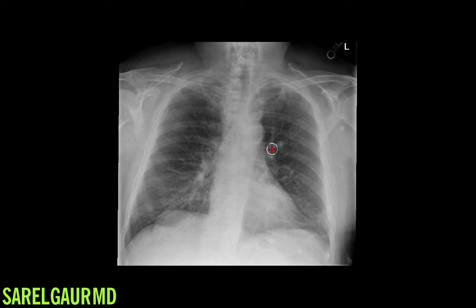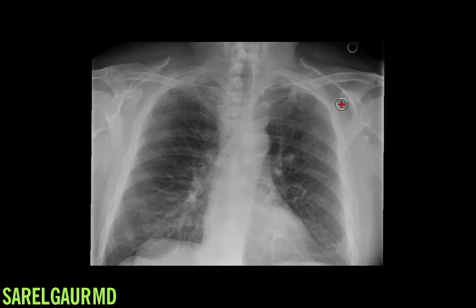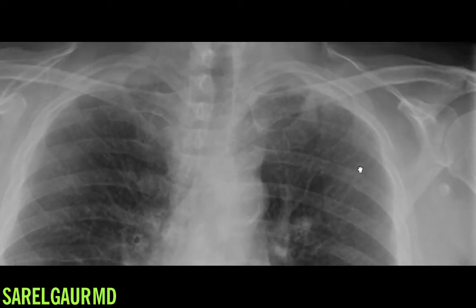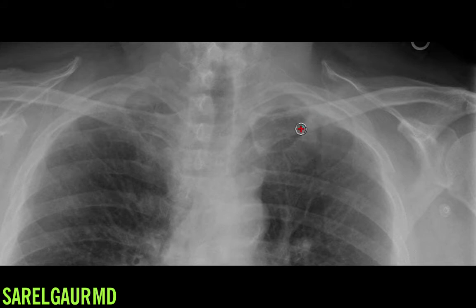Here is a chest x-ray of a 70-year-old patient referred for shortness of breath. The radiologist was quick to pick up this focal area of increased opacification in the left upper lobe, and this is concerning for a nodular mass. The next step is to recommend a non-contrast chest CT.